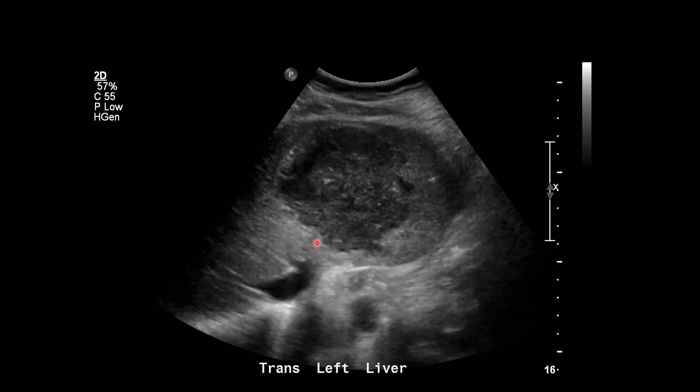Notice how there's some posterior acoustic enhancement, some increased through transmission, that gives us a clue that even though this looks solid, we're dealing with a collection. However, it can be difficult to differentiate hepatic abscess from tumor on ultrasound, particularly if the tumor is extremely necrotic, because then that tumor can also have posterior acoustic enhancement.